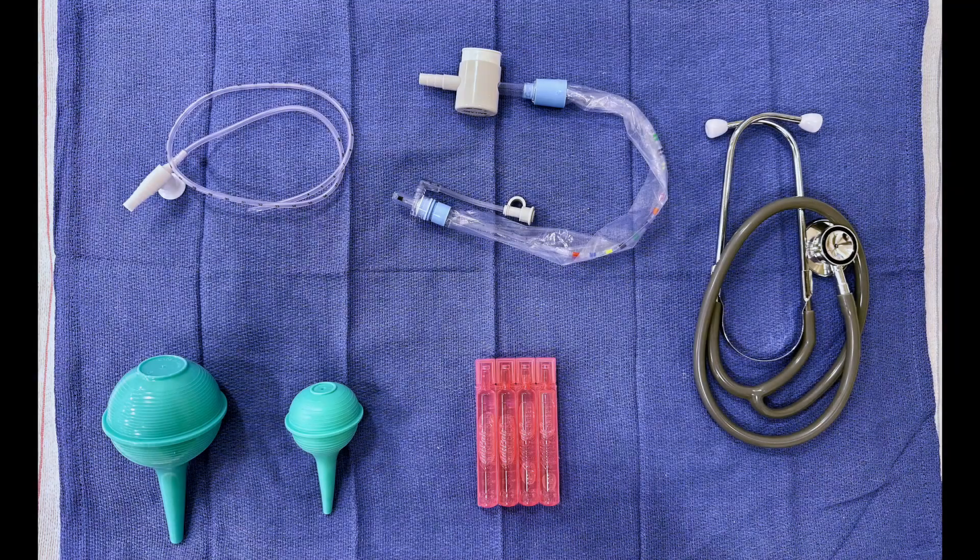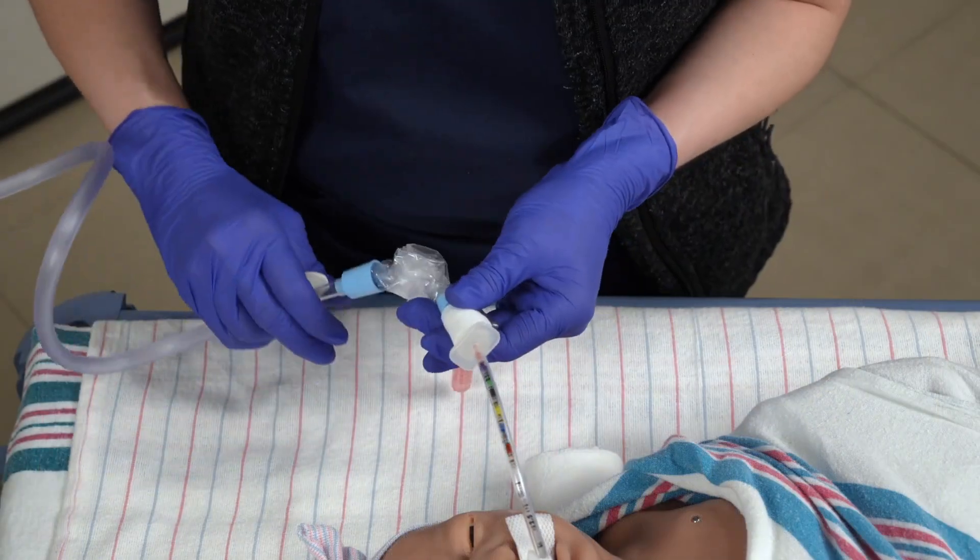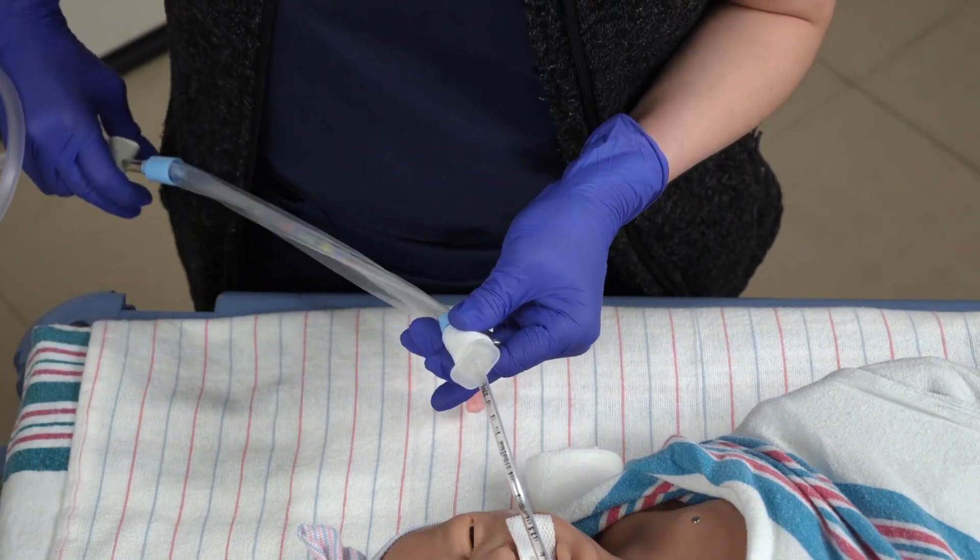There are different suction devices depending on the need of the infant, including a bulb syringe, suction catheter, and an inline closed suctioning system. Suctioning should be done as needed or when clinically indicated.